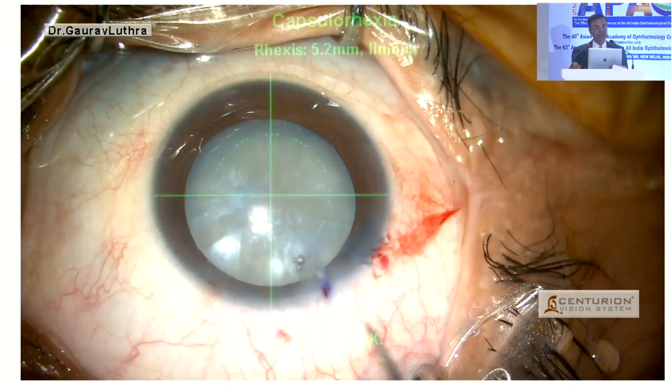So it was just easy to do it, and with the CTR in situ, I find that the CTR itself works like an anchoring point for you down the line. In a few months, it's already fibrosed and nicely stuck all around, and with the IOL inside, you can easily fix it. That's my way of doing it, but I completely agree that 3-piece lenses would be great, especially if you have to glue them later on or do something else, it's very easy to use them for doing it.